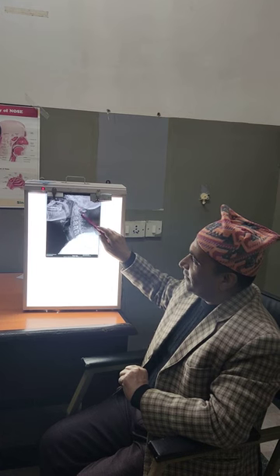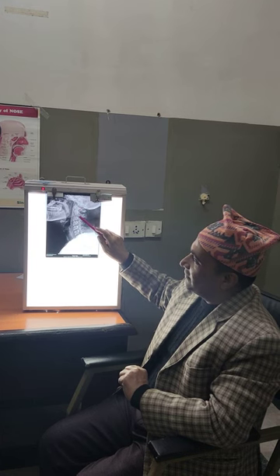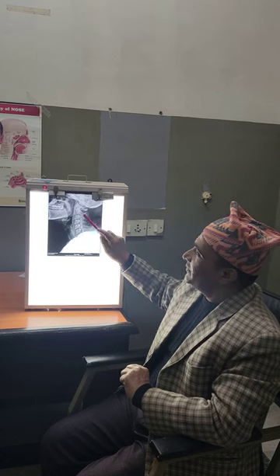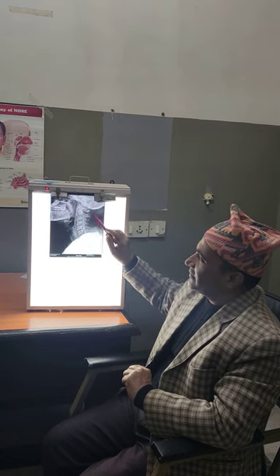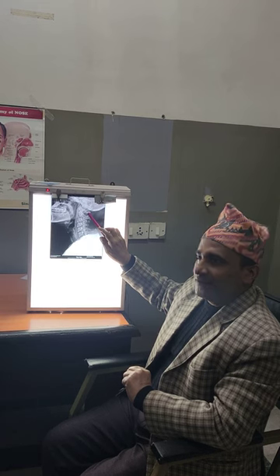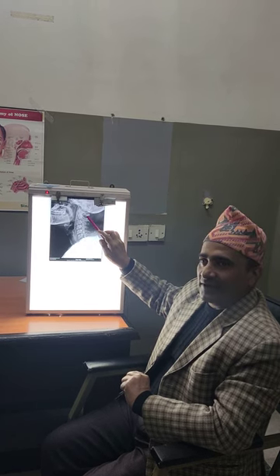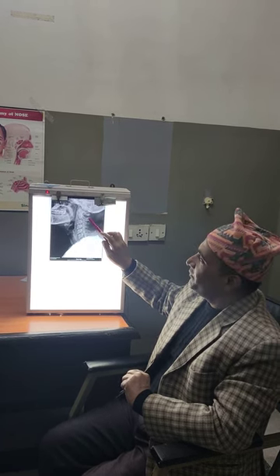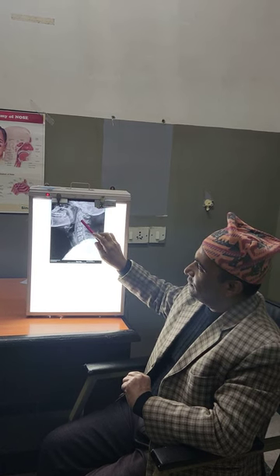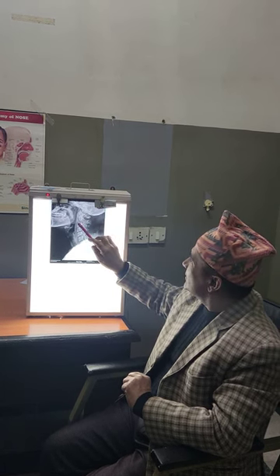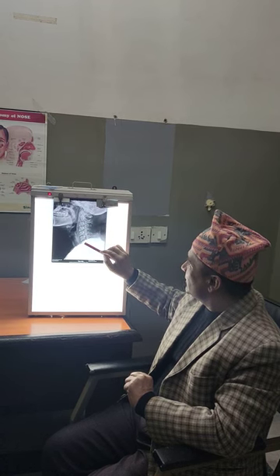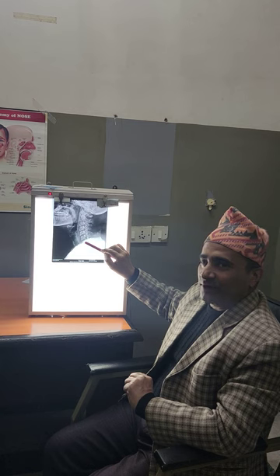Coming posteriorly, you can see the cervical vertebral bodies along with the spines. C1 — the vertebral spine is not present; C1 does not have a spine. It is the atlas, the first cervical vertebra. This is C1, this is C2. Then there is a disc space — C3, C4, C5, C6, C7. This is the most important way to count.